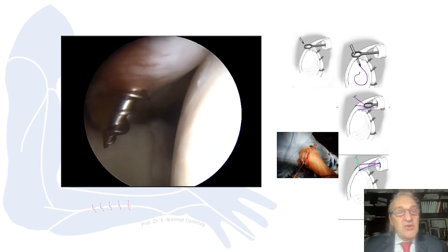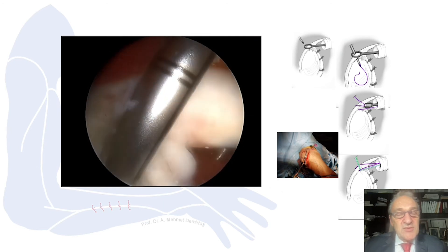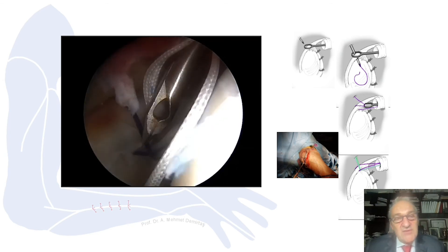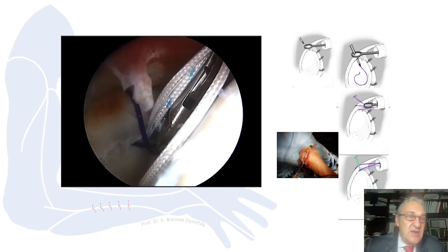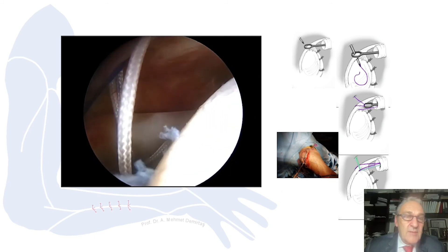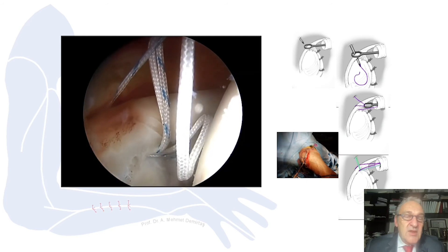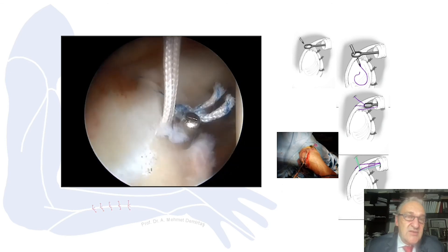Then we place the anchors. I use the Wilmington portal for the anchors because it is safer when approaching at a higher angle. Now we have the sutures and we perform the same technique, using the PDS as a shuttle to make the first knot. As a suture shuttle, PDS is very comfortable and very safe.